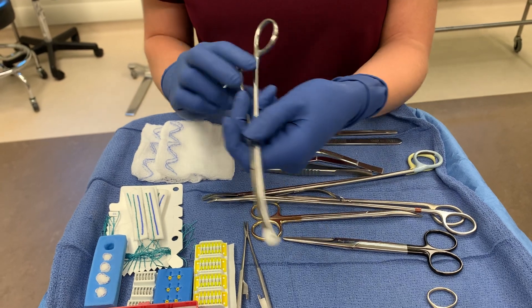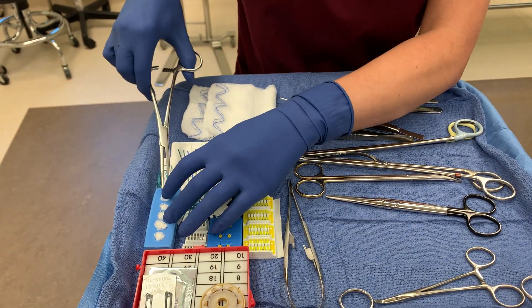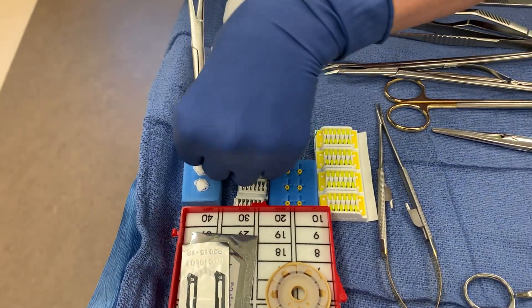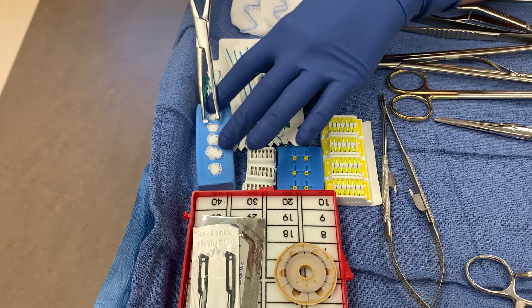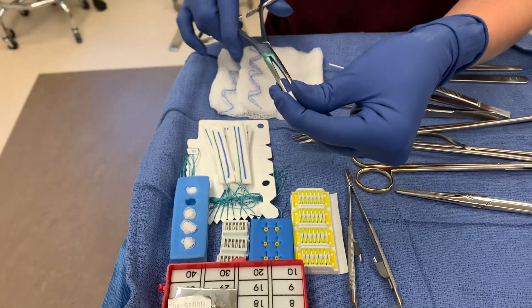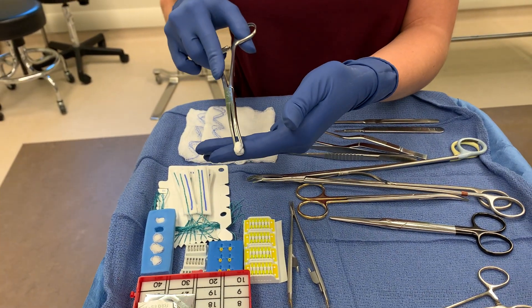This is ready to be passed as well, and they'll use that. To unload and reload, I always make sure I'm over the container, and then I'm going to grab the next one. If they get really bloody, you want to switch them out, because these are used for blunt dissection, and when they get very bloody it's not as effective.